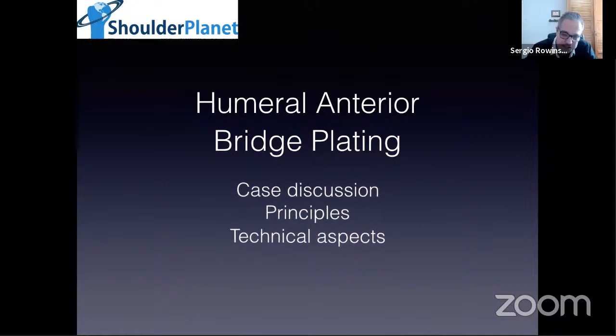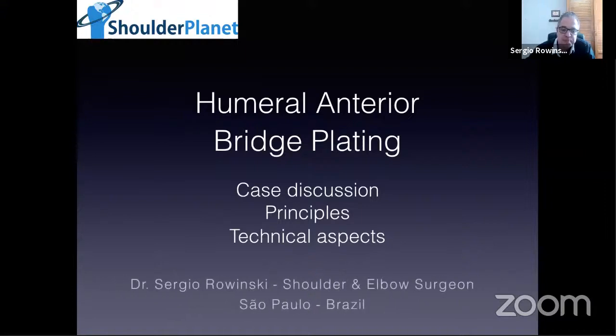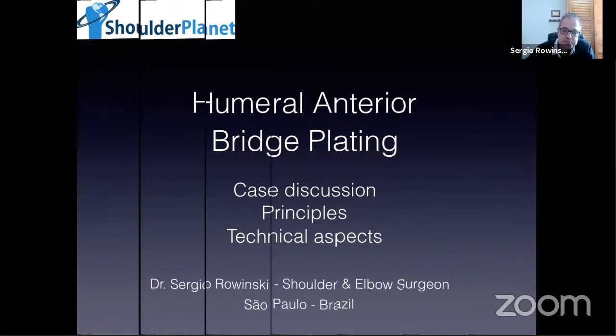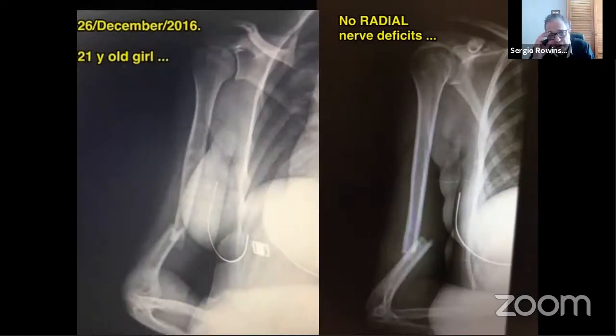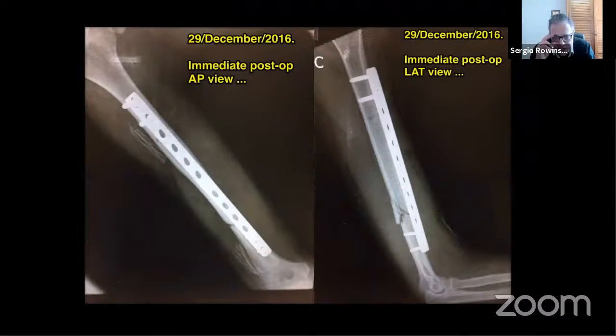I'm gonna discuss some cases and some things that I do a little bit different than Dr. Belangero, and it's gonna be lovely to listen to him after that. So let's start with a very young girl. This is a transverse fracture, a little bit inferior. And as Dr. Belangero said, you can manage these cases with anterior bridge plating for sure. This is the technique that I do. There are many messages in this case.